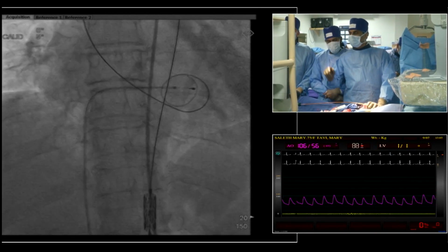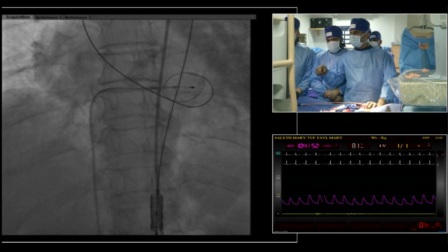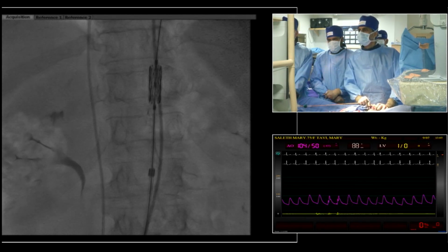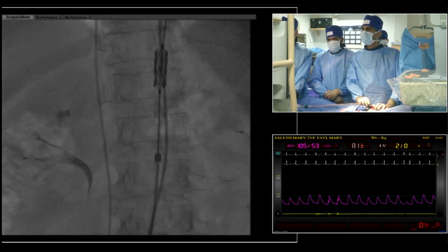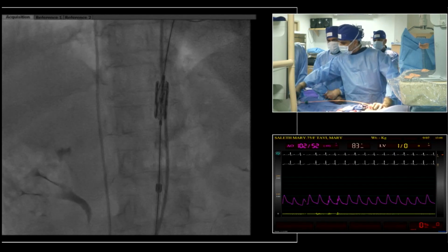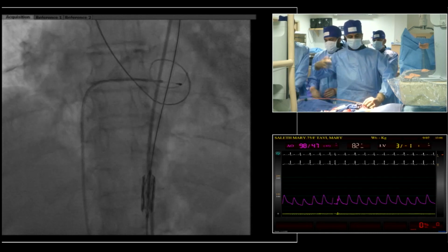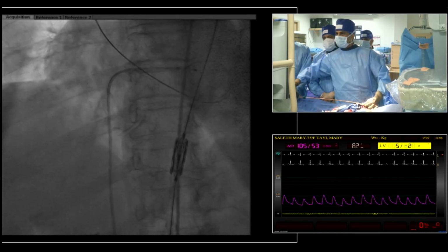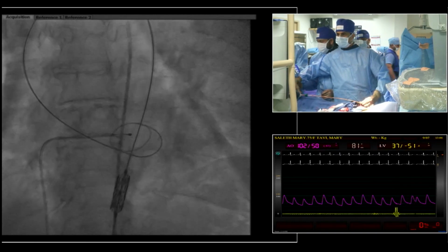So do you want to see the valve coming back into the sheath? No, no, no. I think you can go ahead. I think you should go ahead now. The valve will come back. Okay, so we are going to just move, come lay over please, slowly. So as we go, we also give a slight flexion and go forward.